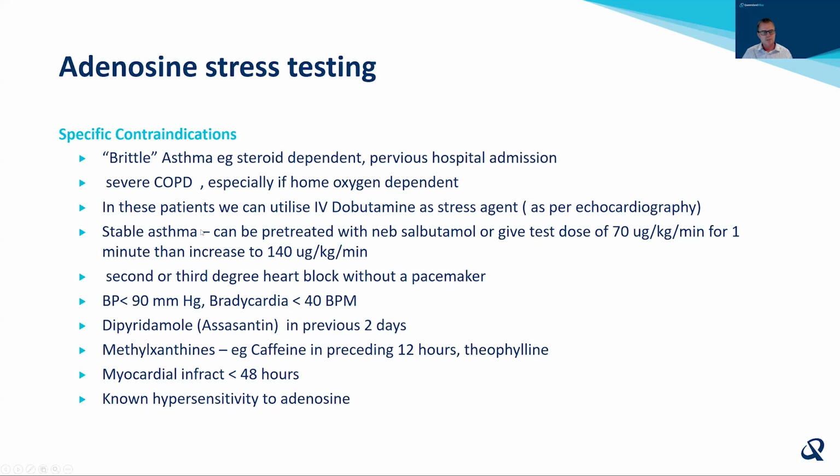and it's done exactly the same as per stress echocardiography. Patients with stable asthma can have intravenous adenosine. What I usually do with them is pre-treat them with nebulized salbutamol, or we give them a half dose for a minute and then bump up to the full dose.